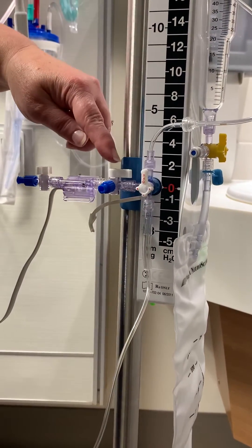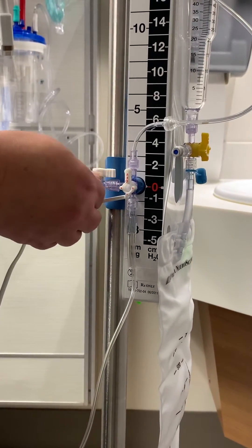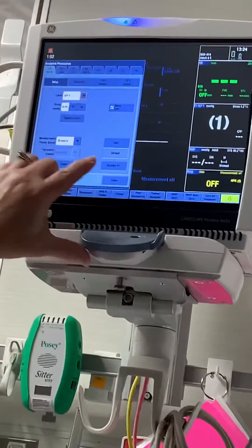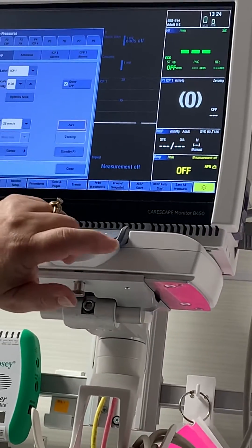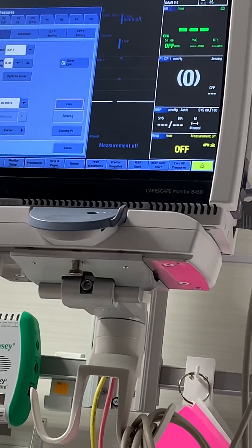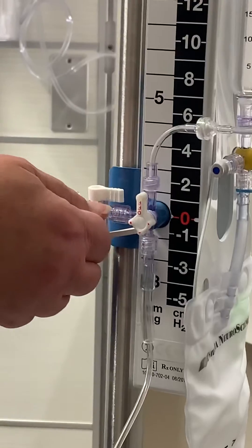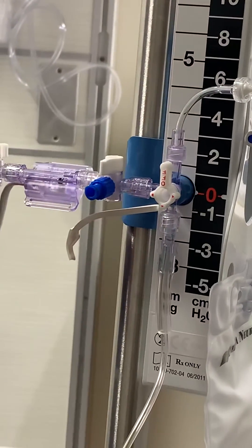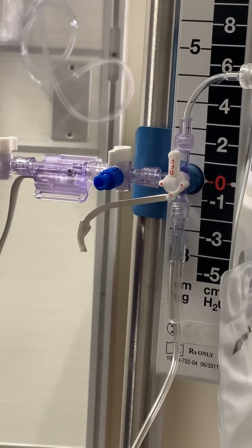We are going to zero the transducer by taking off this cap, and then on our monitor we're going to go to our ICP and hit zero. The monitor will do its zero thing, and then with a new sterile cap, we're going to put the new sterile cap back on and turn your stopcock back off to that port. That way you're back open to the rest of the patient side.